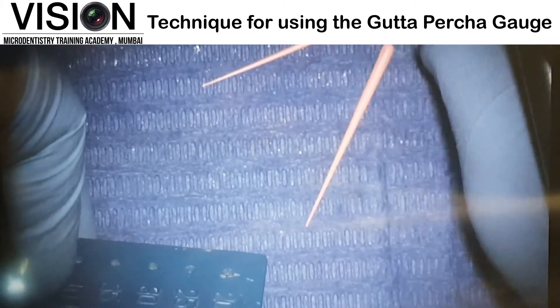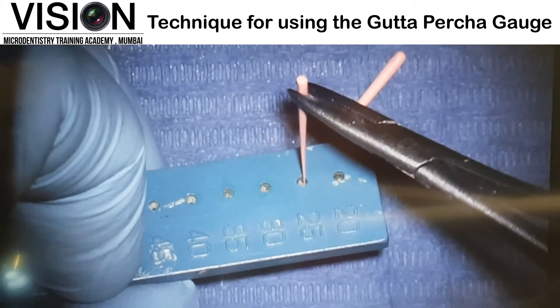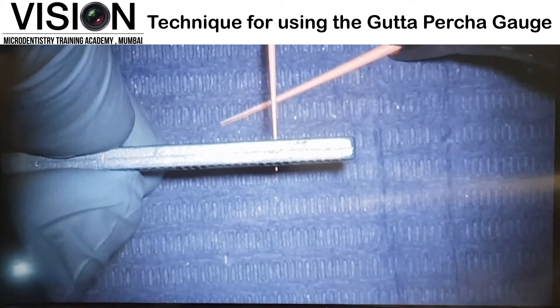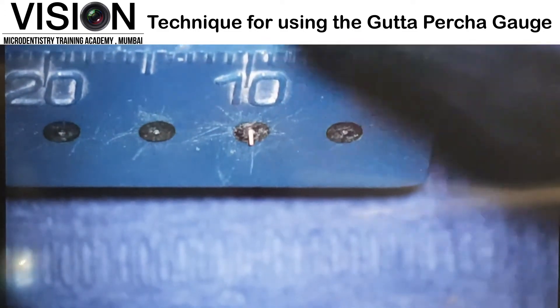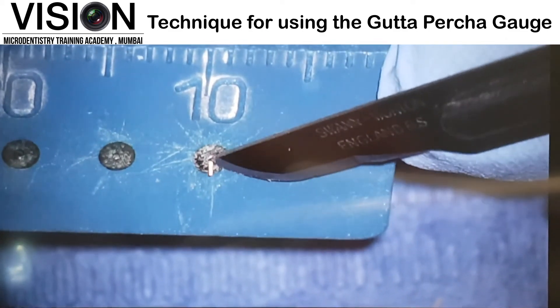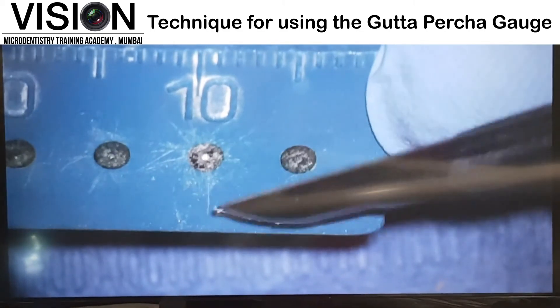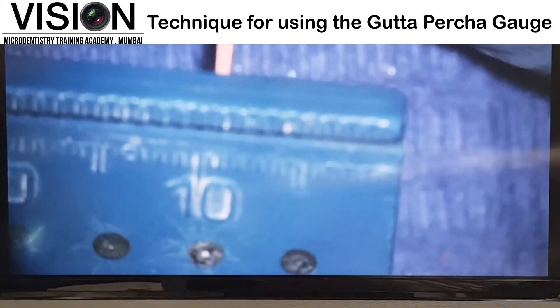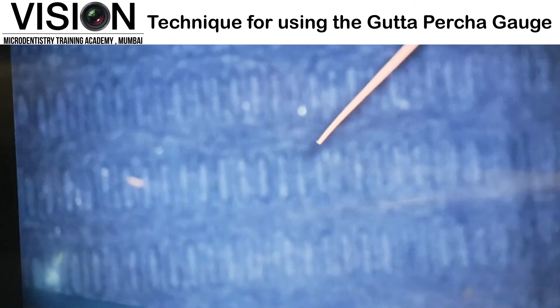The same thing can be done with the other point, that's the fine medium. Let's place it in the number 25 again. Whatever excess comes out is now going to be cut with the blade. You can see the blade is giving a clean incision and cutting out all the excess which is jutting out outside this particular hole. Now what we have is an exact cut of size 25, which can then be placed in the canals.